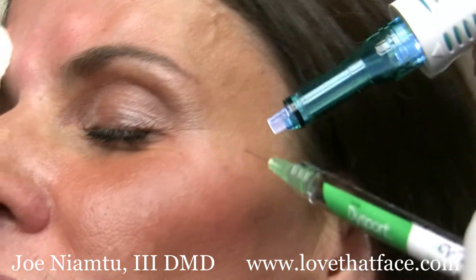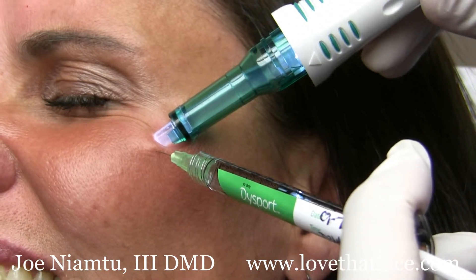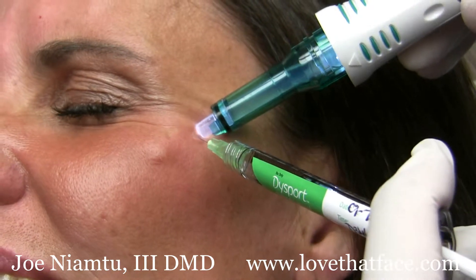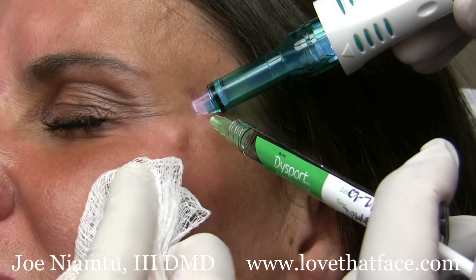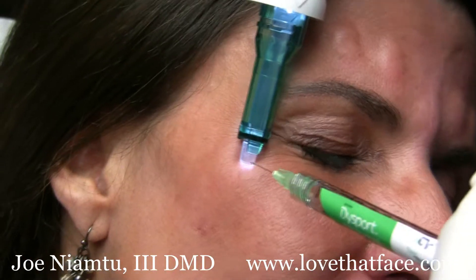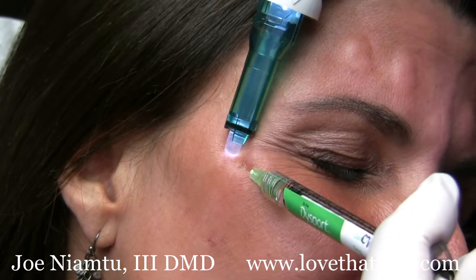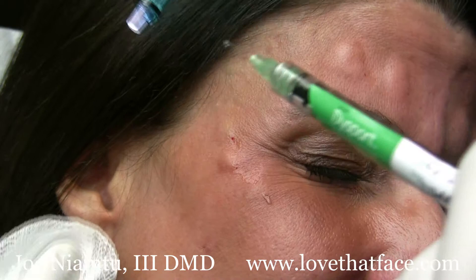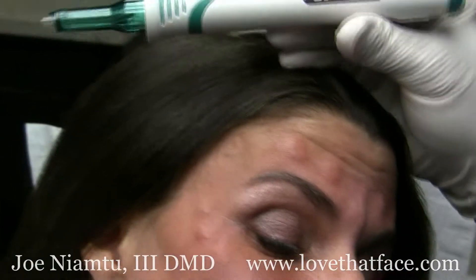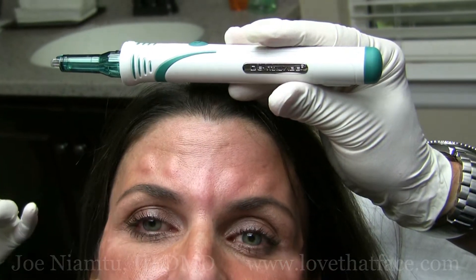Patients love it. So there you go — that's the Dental Vibe. A little device that helps patients have better acceptance with cosmetic facial injections.